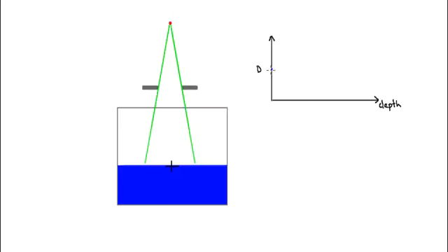Measure the dose at that point with a chamber, and here's your value here in this curve. So that gives you something near the surface. Let's fill it up a little more. We take another measurement. It's up here. Fill it up a little bit more. Measurements a little bit higher. Remember, this is the buildup region, right? So as we fill up, the dose is getting higher. And it gets up here. Now this point is actually that special point. That's the D max point, the point where the dose is maximum.